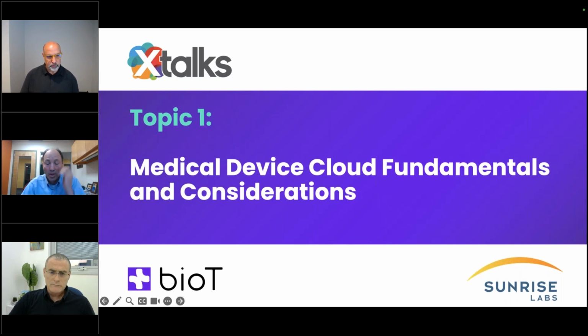And one of the things, all the data is really positive, like I said, if you are going to improve your algorithms. But remember that usability is an important part of a medical device. So user studies are done, and you look for user mistakes that can lead to reduced safety and efficacy. And you can monitor that when you have a connected device. You can look at the user interactions and see what is effective, what kind of mistakes people make, and that can be a critical thing on a medical device. It's considered just as important as the clinical efficacy of it.